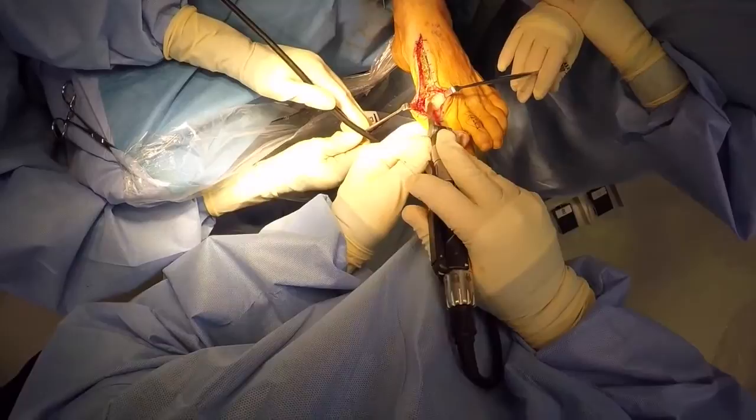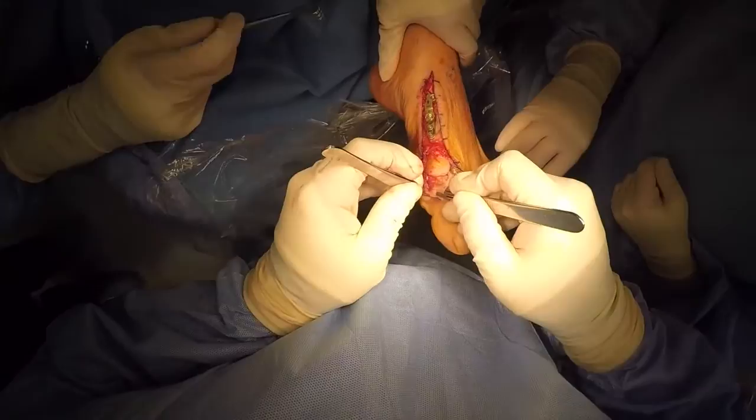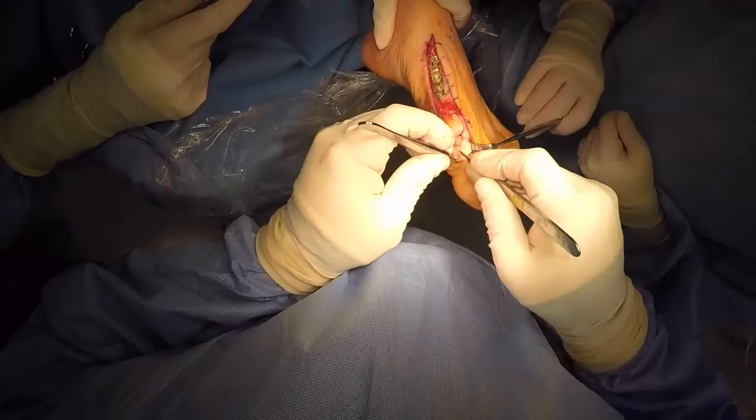We are additionally preparing the joint here, removing dorsal and medial osteophytes, and we will also use a rasp as well. So here we are completing our dissection of the proximal phalanx for preparation of the Akin osteotomy.